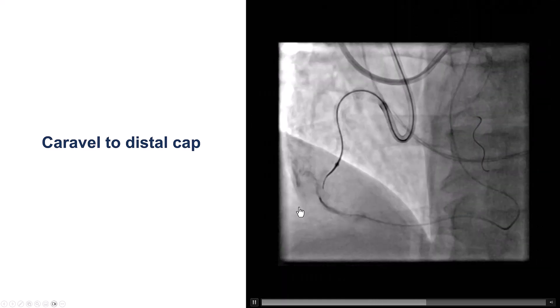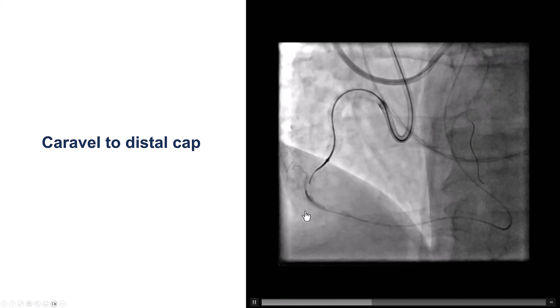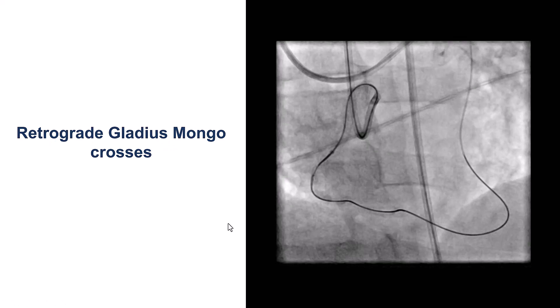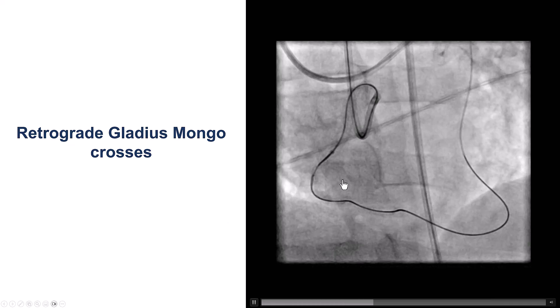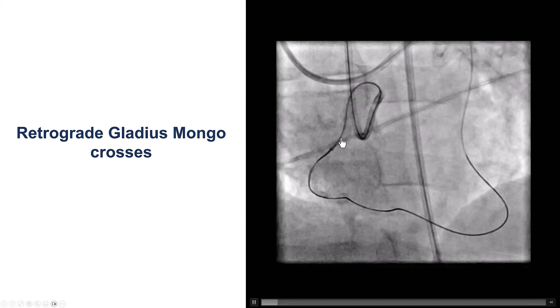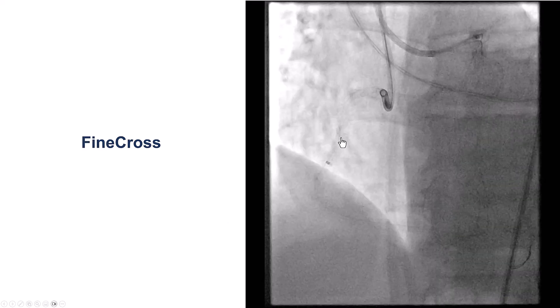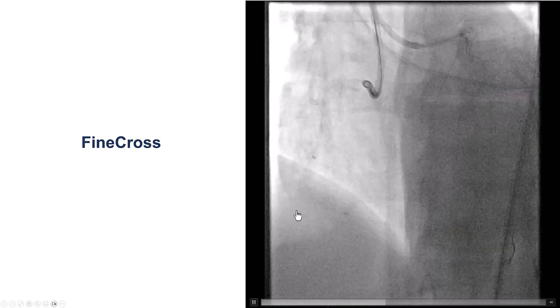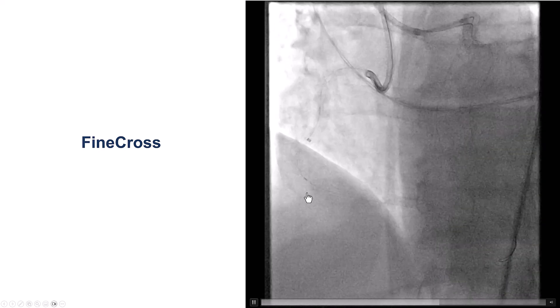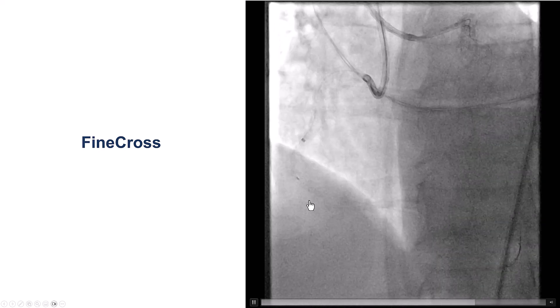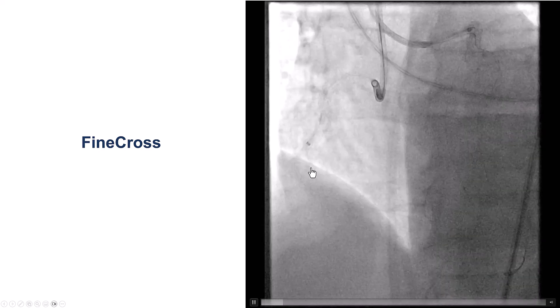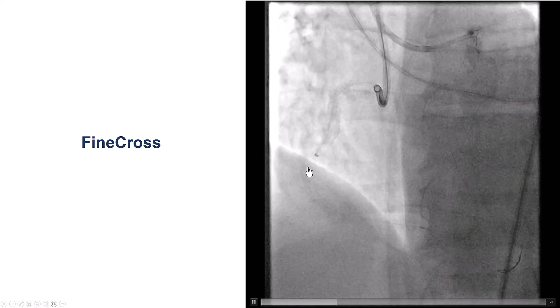We then tried to cross the CTO with different guide wires. This is a tip injection. We moved the microcatheter further back, and eventually were able to advance a Gladius Mongo guide wire retrogradely through the occlusion. We then tried to deliver a microcatheter antegrade using a Fine Cross, but unfortunately we could not cross with the Fine Cross through the mid-RCA CTO.